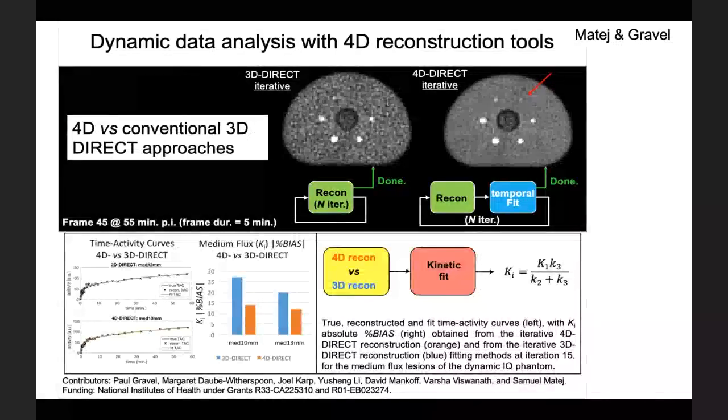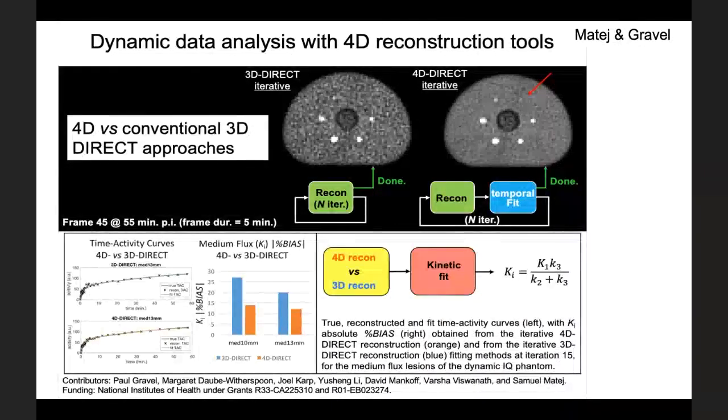And in fact, you can build the time domain into the scan and only have more efficient reconstruction and production of parametric images. But in fact, you can, if done in certain ways, apply some biologic constraints in addition to physical constraints in the model and improve the image quality, and we think the quality of the quantitative data significantly. This has also been done with post-reconstruction methods. We've been working with Finbar O'Sullivan, a longtime collaborator back from my days in Seattle, who's been doing post hoc approaches through a mixture analysis approach where, again, the biologic constraints that can be provided by the image can provide a very efficient modeling system and a significant improvement in image quality, as you can see from these approaches.